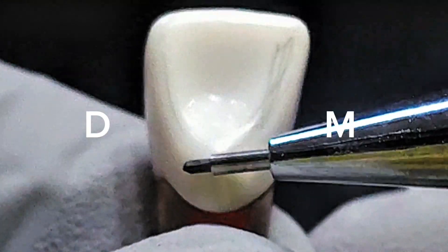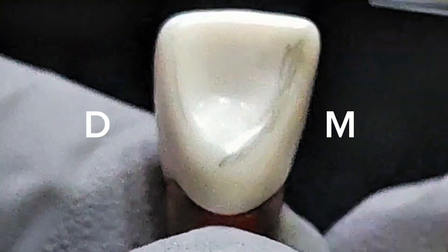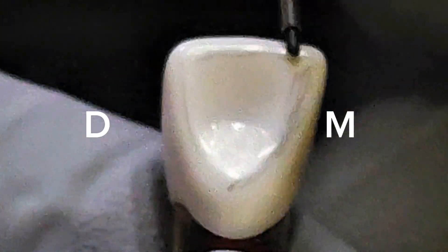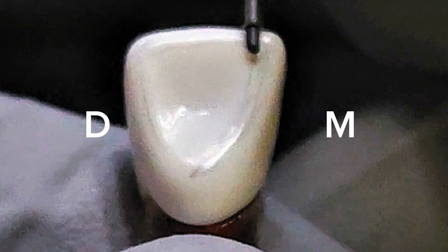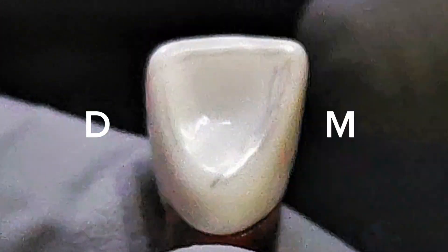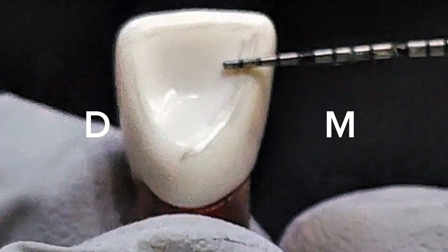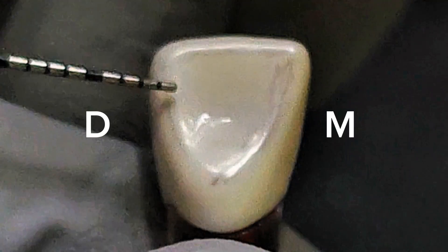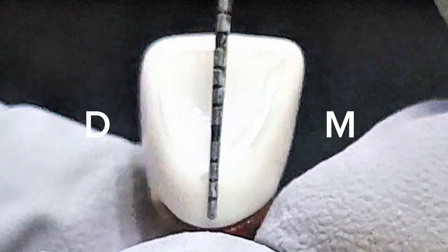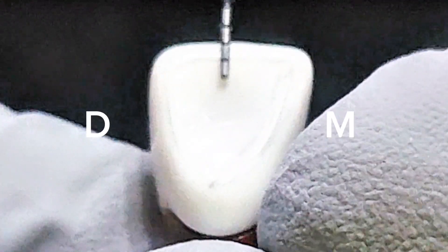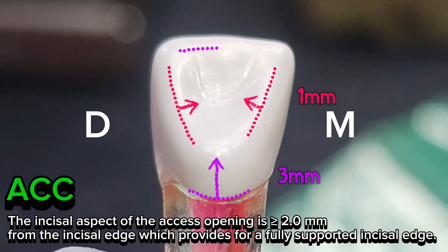So 1mm, and I'm just marking the borders. These are the borders - 1mm and 1mm and 3mm from the CEJ of the lingual area, and 2mm from the incisal ridge.